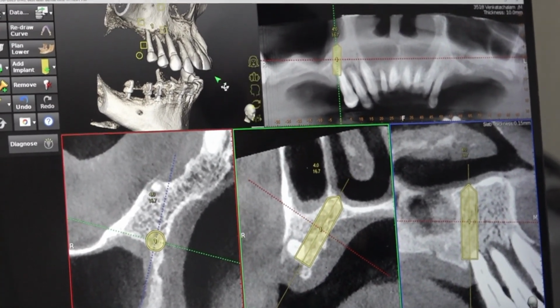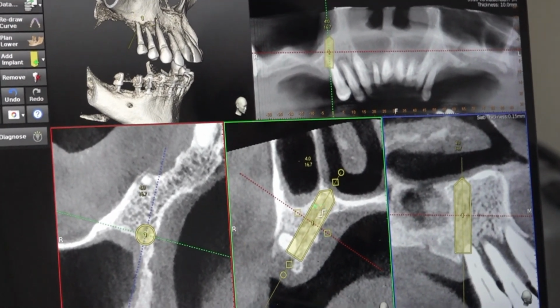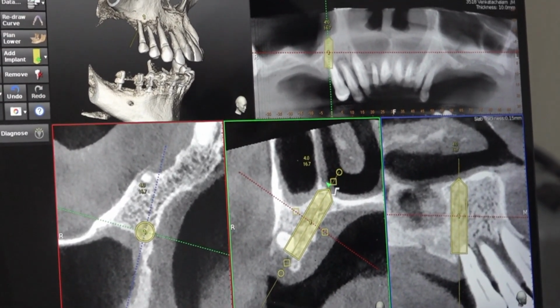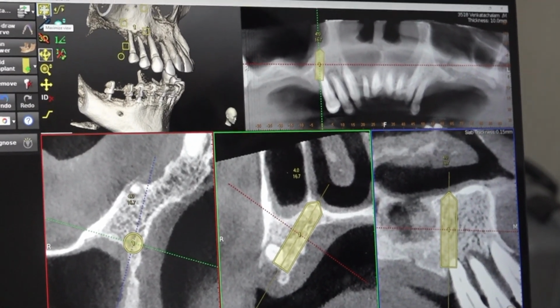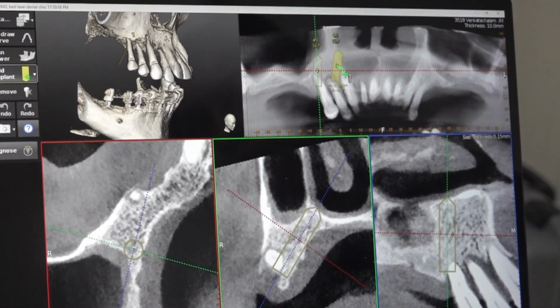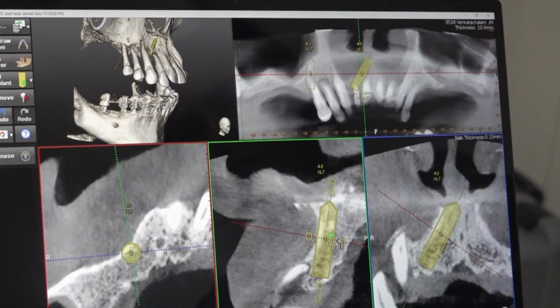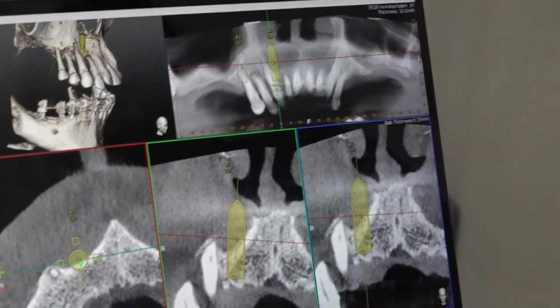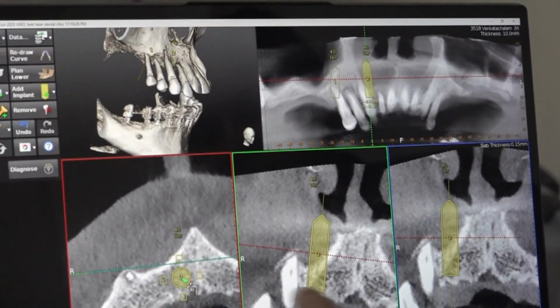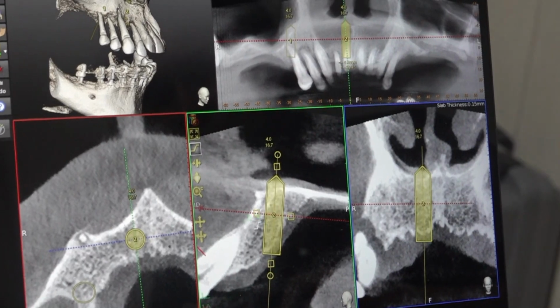Anyway, we are going to place compression implant, so it will get stability from here by compression and by second cortical bone from the nasal. So it will get a good stability. There is no doubt about that. So second implant we will place in 1-1. Okay, that's the key area. This is one trick. Instead of adjusting here and there, you can just pull it towards the midline.